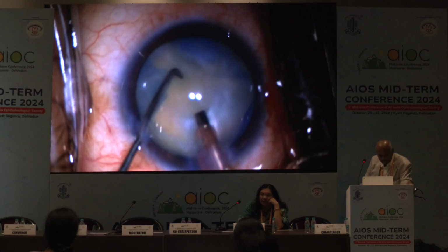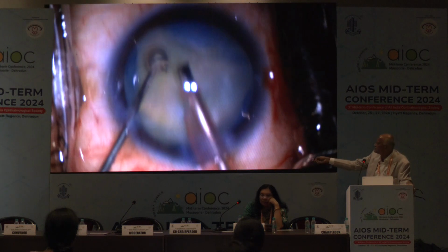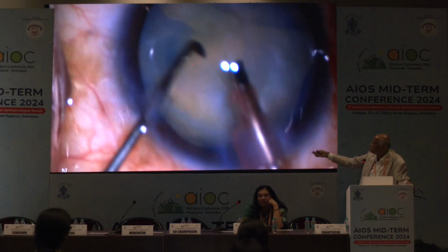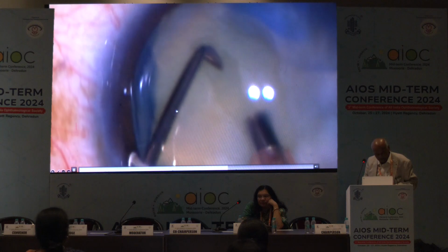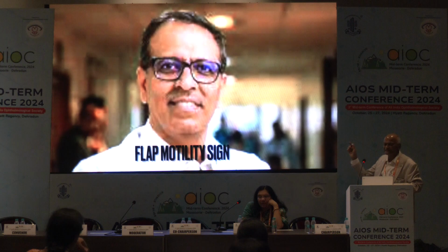Now here you can see this flap. Can you see this flap? Whether I can do phaco or not is possible to know only by this motility sign.